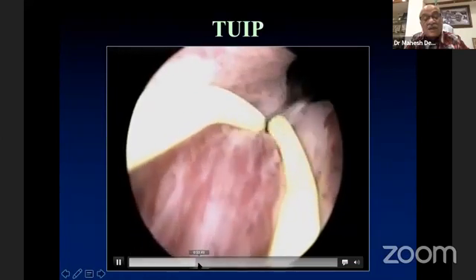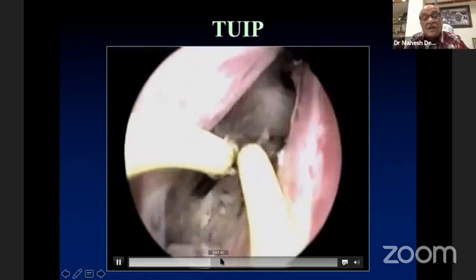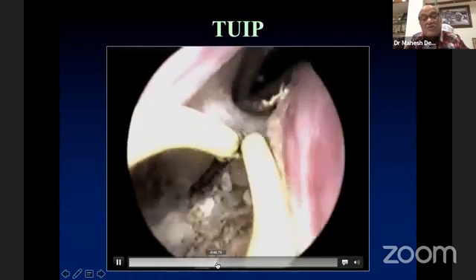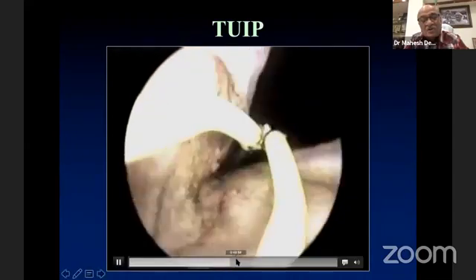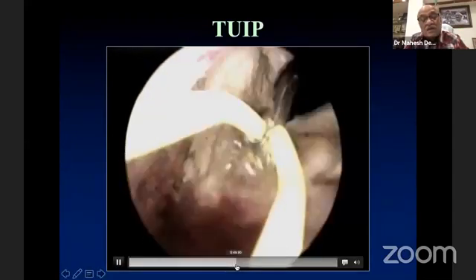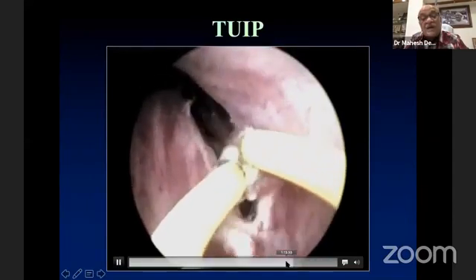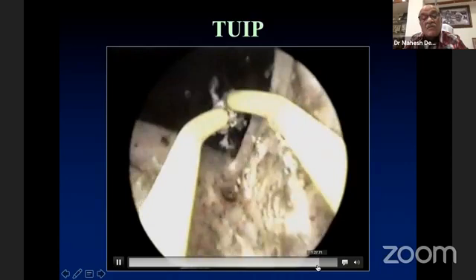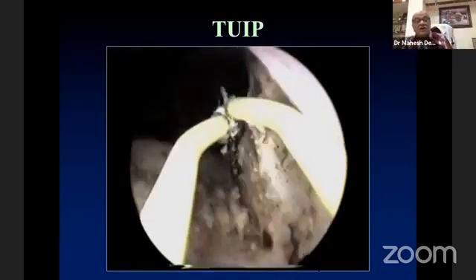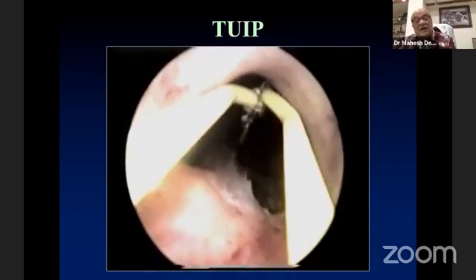And here you make a deep cut, making a deep cut in the fibrous tissue, because this is a fibrous gland, because there's hardly any tissue there. You make a deep cut, and then you divide that. Similarly, you do it on the other side, again lateral to the ureteric opening, and then you can divide that. So the whole floor will go down. Now, initially when you entered and did a cystoscopy, you could not see the bladder. Now you can see the bladder. So that is how you do the bladder neck.